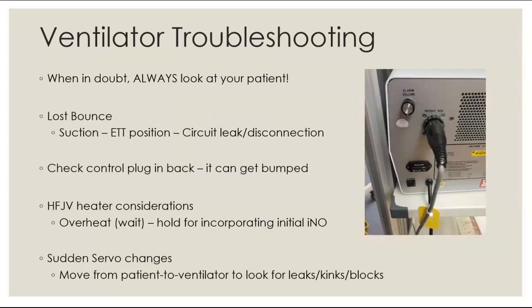So, ventilator troubleshooting. When in doubt, always look at your patient. Do we have a good bounce? Is our ET tube where it needs to be?